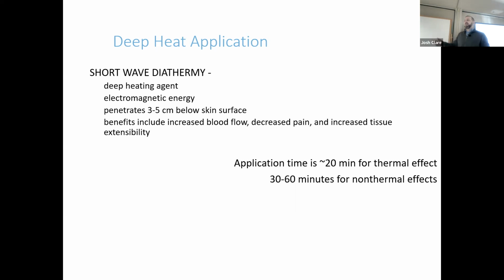That guy that I was taking on as a patient, yeah, he got it every single day because it felt nice. What does that mean when we're creating a thermal effect? It feels nice. We're introducing what? That's part of it. Non-painful stimulus, great. If we can introduce non-painful stimulus, I'm happy. I don't care what the machine is or how silly it is. Patient likes it. If we get to put diathermy on a guy's quad for 20 minutes and then he can do great exercises to then get him home sooner, all right, I'm in.